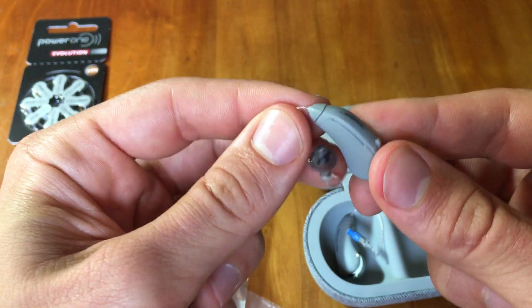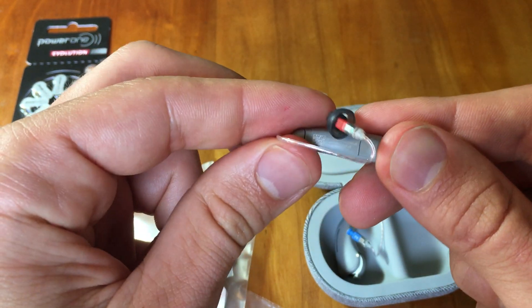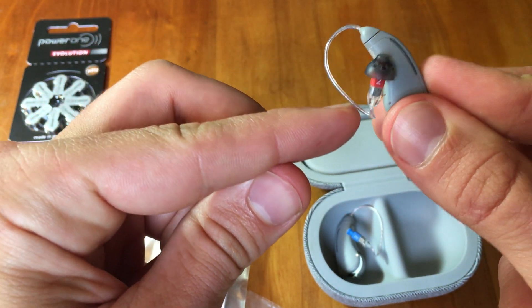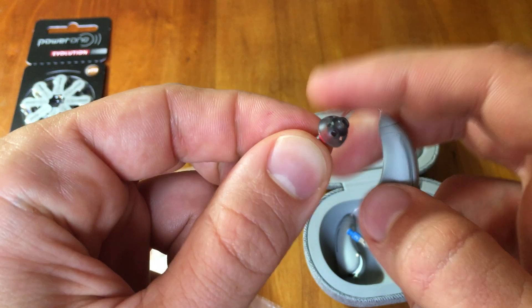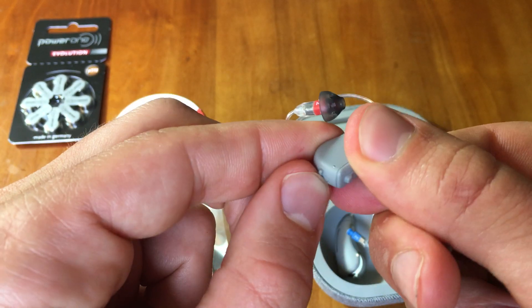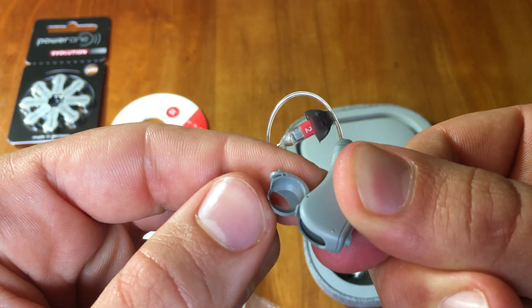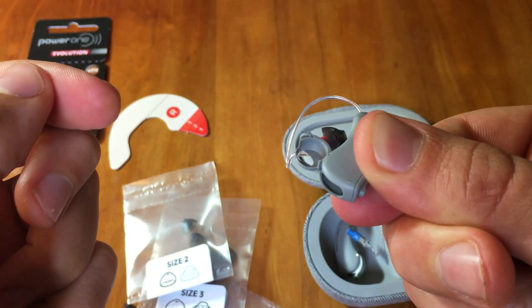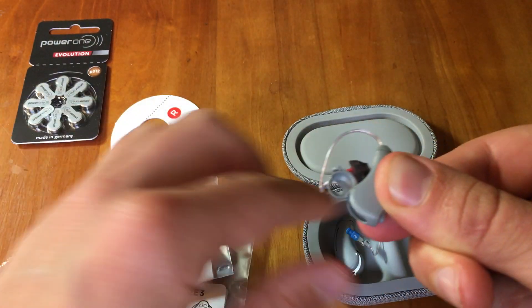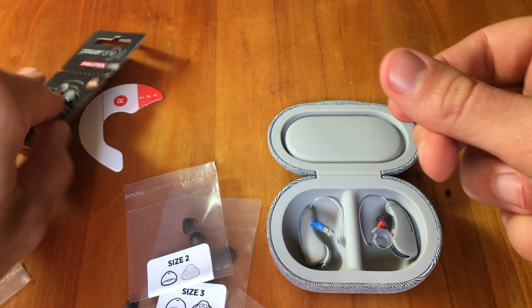Again, here for the right ear, you can see the volume control, the Bose label, the wire which sends sound information through to the speaker, and the rubber tip that goes in your ear canal. Down here is the battery door. Opening this battery door will allow you to put in a new battery — I'll show you how that works.